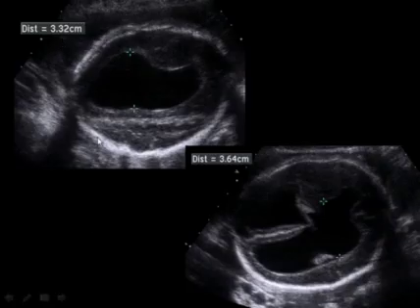Well, why does it matter? Here's an example of a fetus where we were measuring both right and lateral ventricles, and clearly there's hydrocephalus. There's no question that these ventricles are dilated. But if you notice on this up ventricle, the measurement is 33 millimeters, but here's the falx. And the presence of the falx in the back third of the head tells me that we're oblique through the head. The falx should be running right down the middle. So we have artificially increased the size of this lateral ventricle.